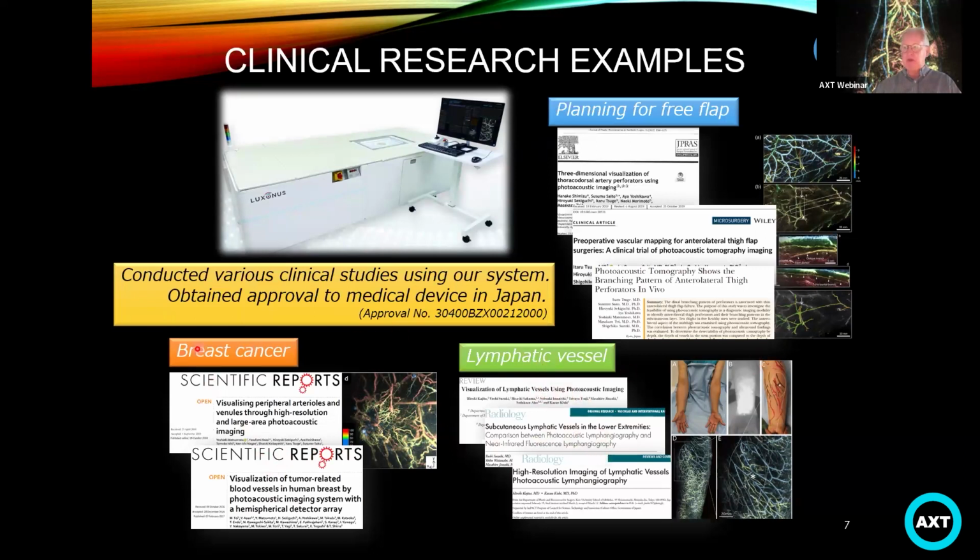So these are the first early clinical applications. For preclinical applications, this is still fairly early days, but you'll see in some of the imaging examples later that this does show a lot of promise.